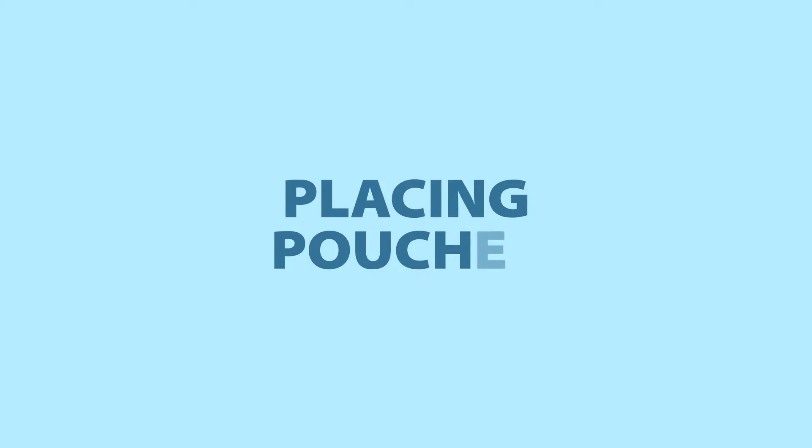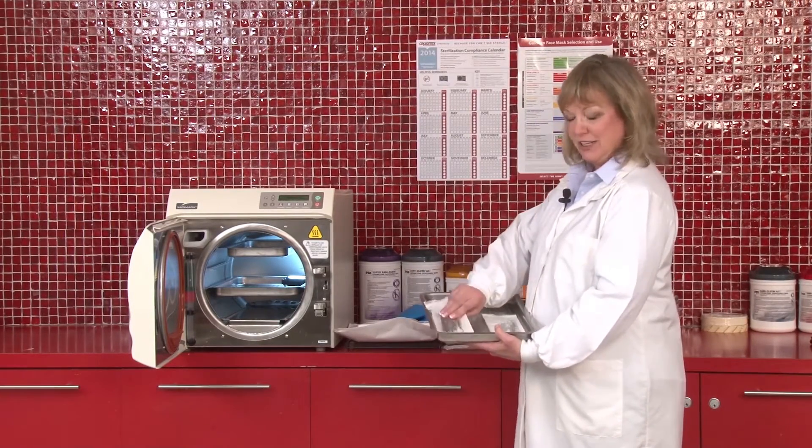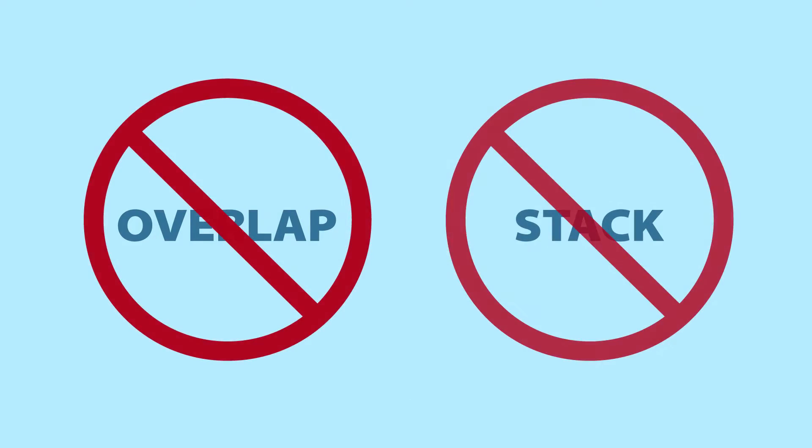When placing pouches into the sterilization tray, you want to make sure to place them in a single layer. You want to have at least a quarter inch of space between each pouch. You don't want to overlap the pouches. You don't want to stack the pouches.